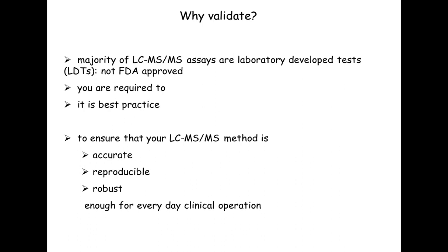So why should we validate our assays? Well, in some regulatory environments, you are required to validate your method. And these requirements may vary depending upon exactly what function your laboratory has.